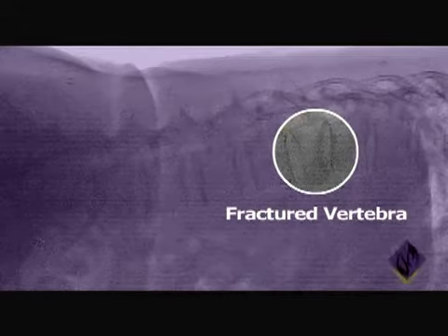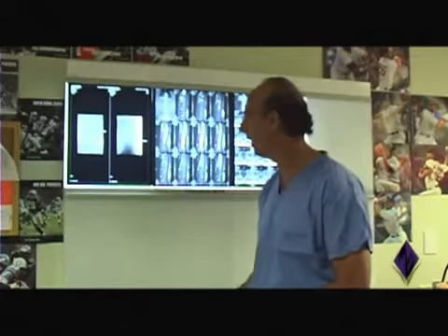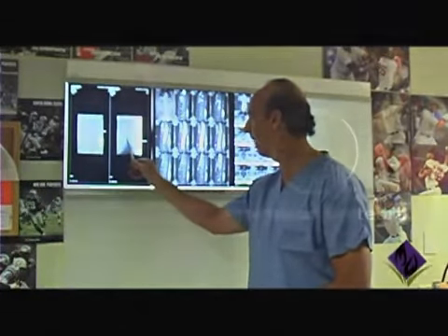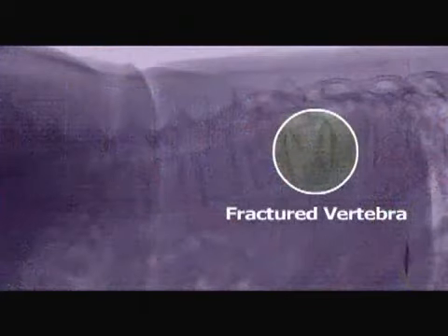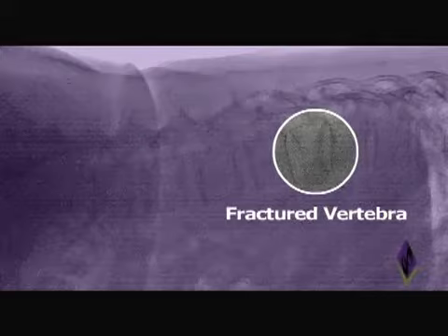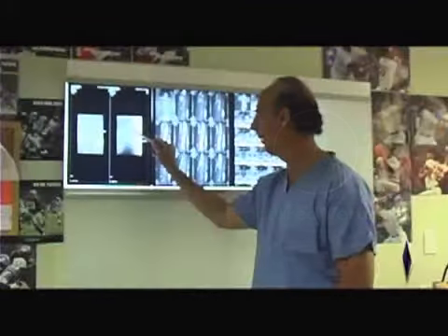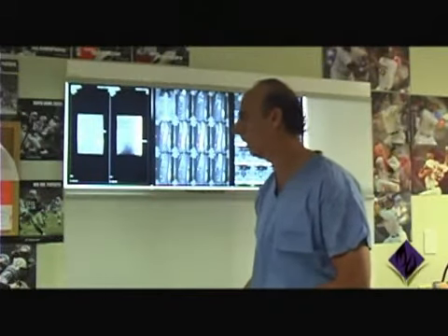These are the normal appearing lumbar bodies, which are either rectangular or square in shape. There's an inferior end plate, which is the bottom of the body, and the superior end plate, and these typically are very sharp linear configurations. In this patient, this is the T12 body, which corresponds to where the pain was, and this is markedly compressed with a dipping deformity of the superior end plate and a similar deformity of the inferior end plate. This confirms the presence of a compression fracture.